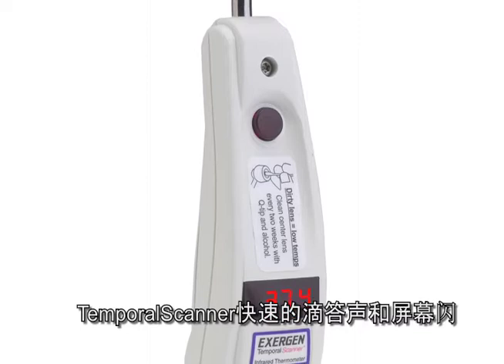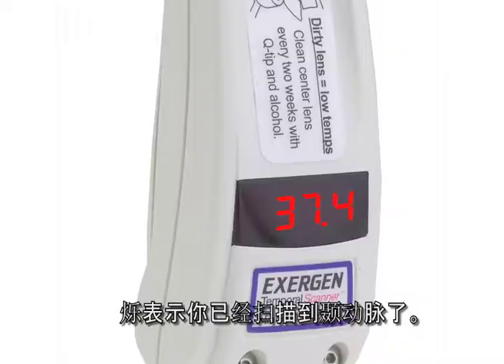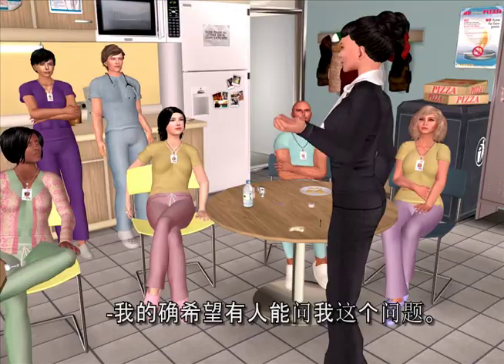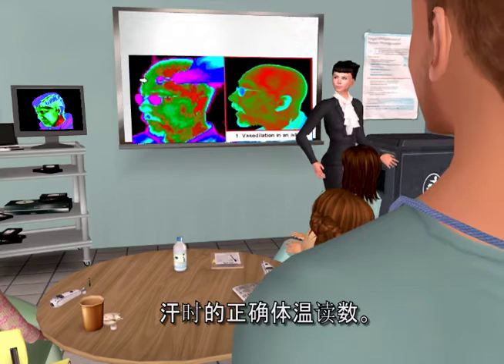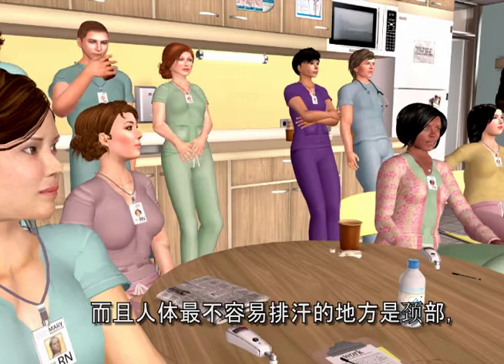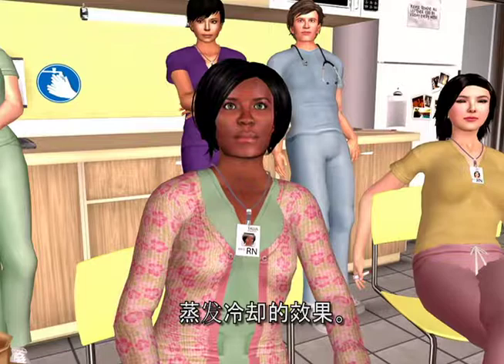The temporal scanner will indicate that you're scanning over the artery by faster beeping and faster flushing display. After you pass the artery, the beeping and the display slow down. The touch behind the ear is to assure the correct reading if the patient is sweaty. If the forehead is moist, evaporative cooling will result in a low reading. However, since vasodilation is 100% assured when sweating and we sweat less on the neck, that touch on the neck just behind the earlobe will override the effect of evaporative cooling.